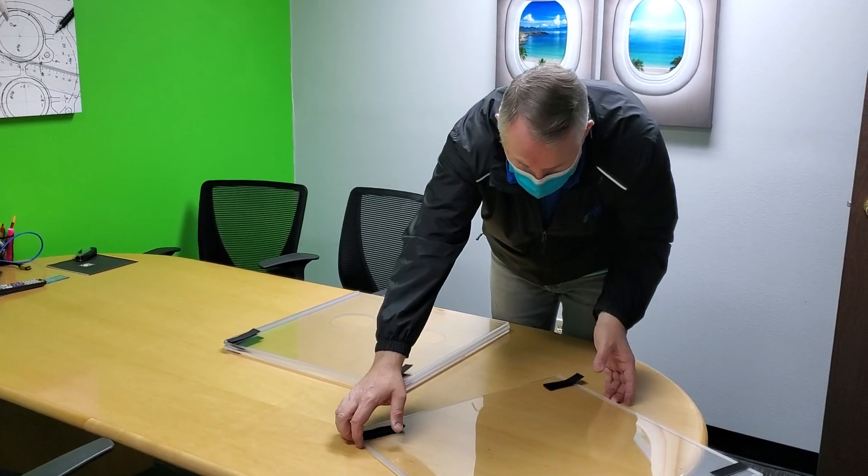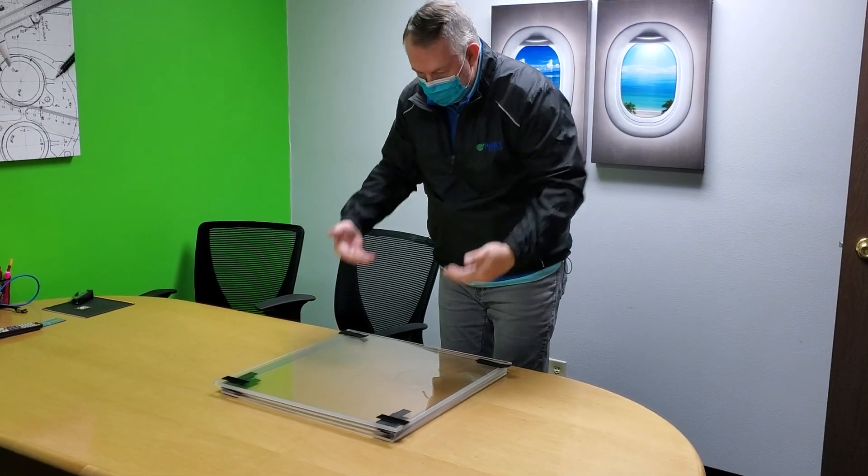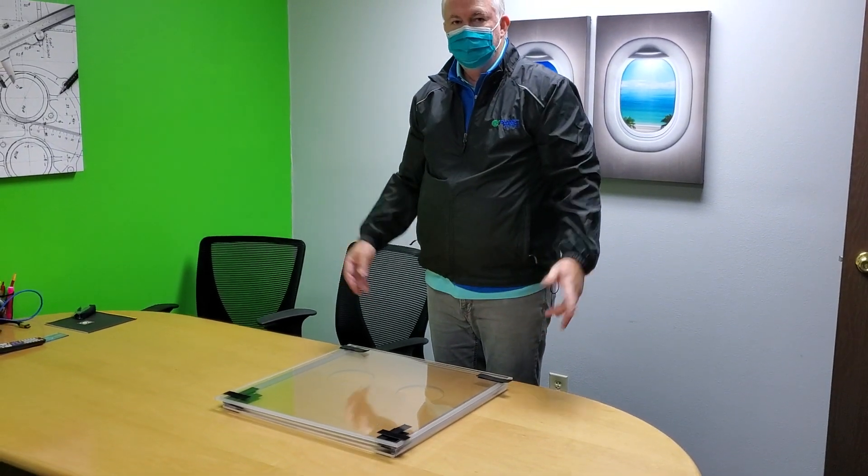There are 12 additional pieces to hold it together. Put that on top, replace it in the box that it came in, and you're all set.